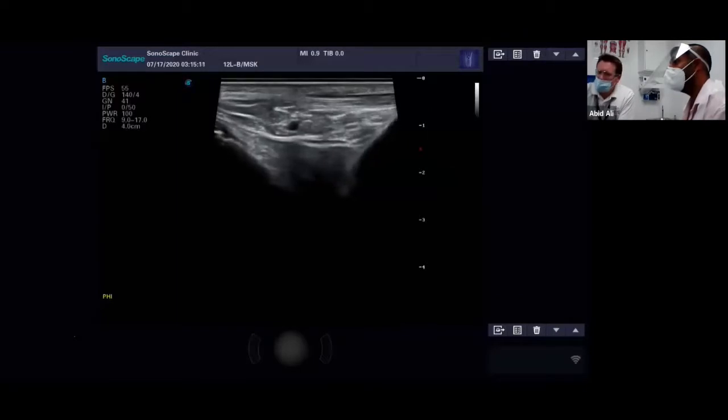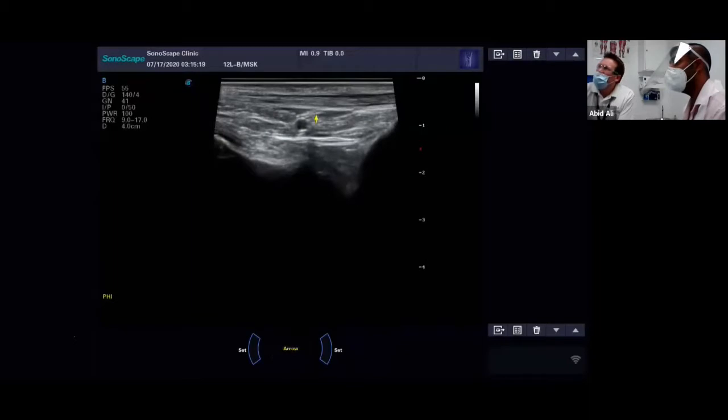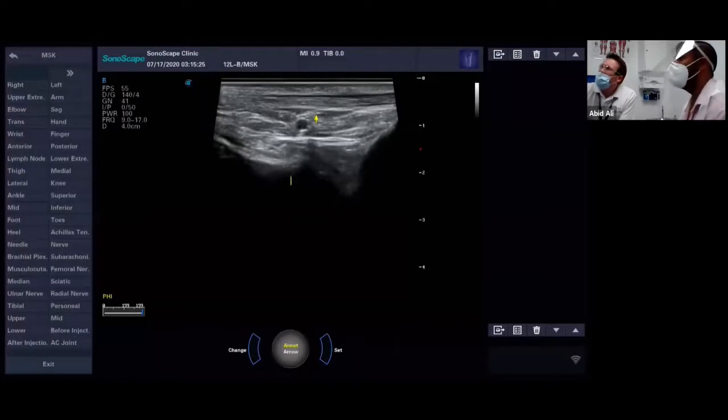Let's put the tendon in the view. Okay, so here's a nice image for you. Would you like to annotate that for me? So we're on Tibialis Anterior then. Yeah. So this is Tibialis Anterior at the top here. There's your tendon. So this will be the tibia. You're just seeing the end of the tibia there. Then you're seeing a space in the middle, which we'll point out in a second. And that's the talus starting to come into view.